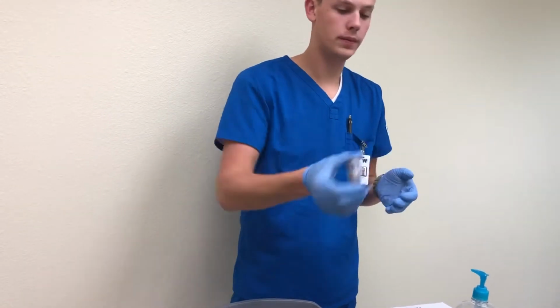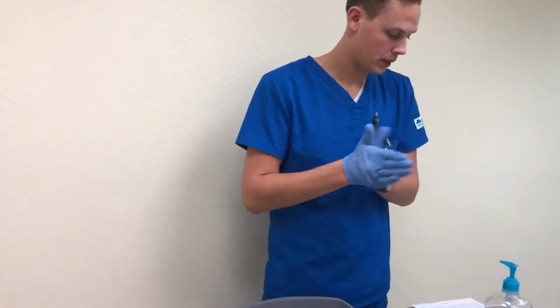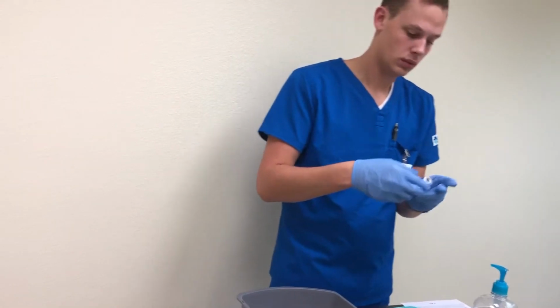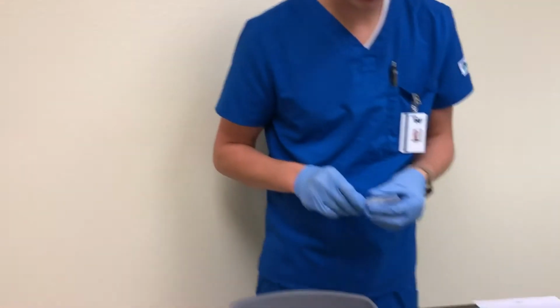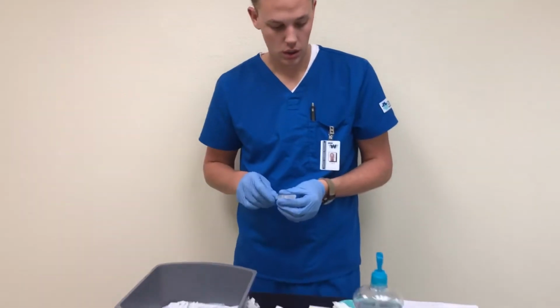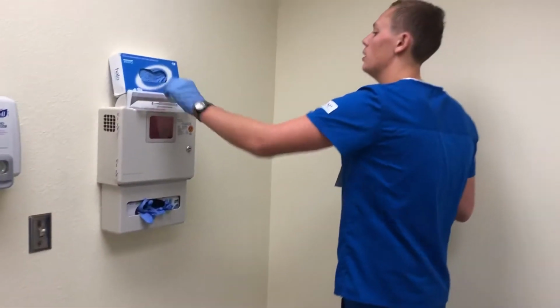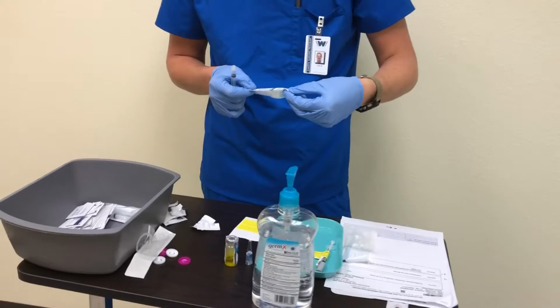Again, inverting to make sure I get anything that's in the cap. Okay, and we're all mixed up. So then we're gonna switch needles, because then I'm going to be withdrawing, so I'll just put the cap in sharps, and get out this 21 gauge.